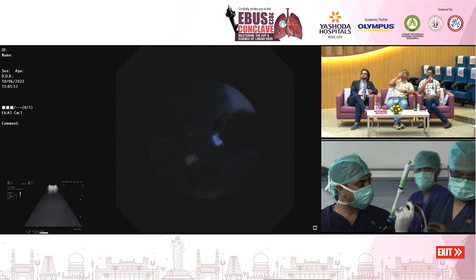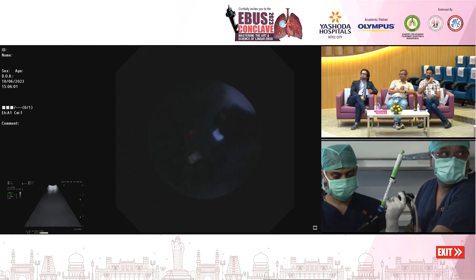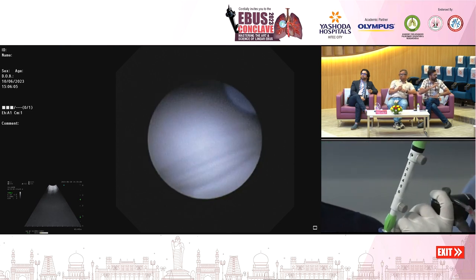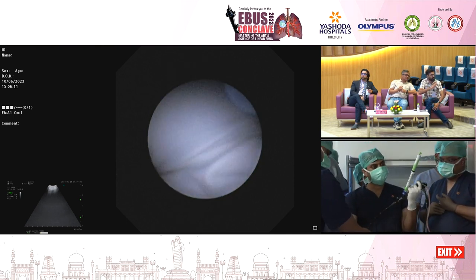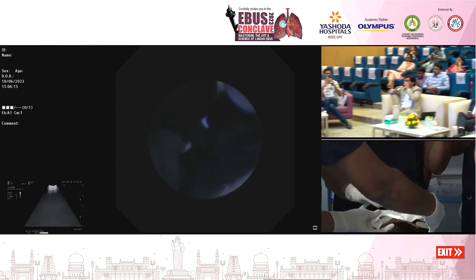So there are two knobs which you can see in the needle. One is for the sheath to be fixed and the other is for the length of the needle. So how much should go in, we have to decide. The previous one was fixed at 2 cm. It does give us an option to go up to 4 to 5 cm. Dr. Nikesh, you can start the procedure as you do, we'll keep on.